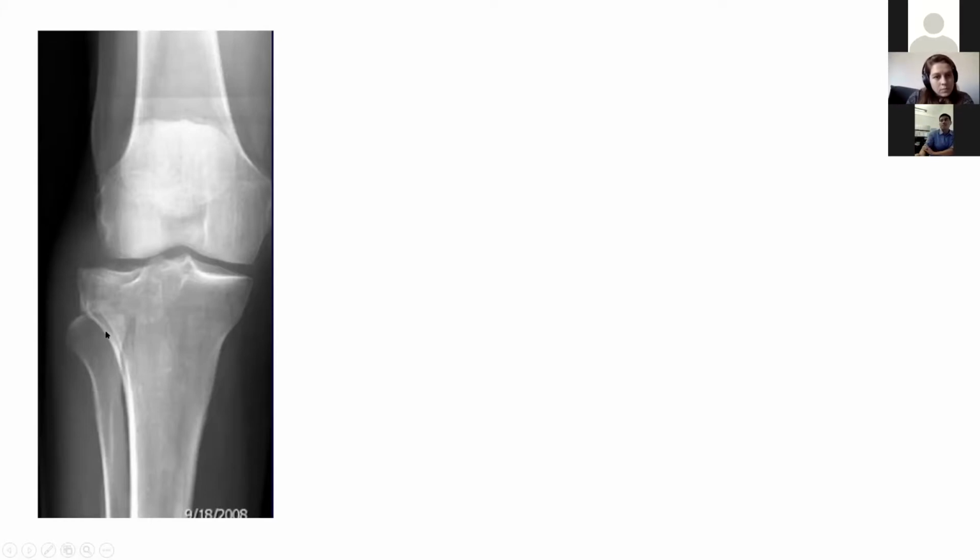I imagine it's there. It's got to be there, but I can't really make out exactly where it is. It's probably somewhere around here. Yeah. What about this business right here? I think it's widened. Yeah, for sure. Totally. I got some fancy stuff to show it.